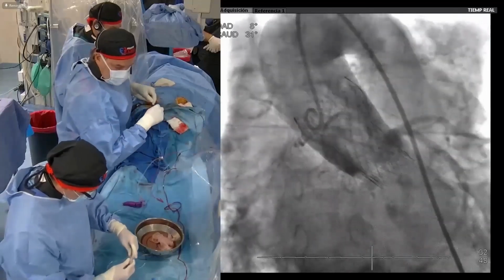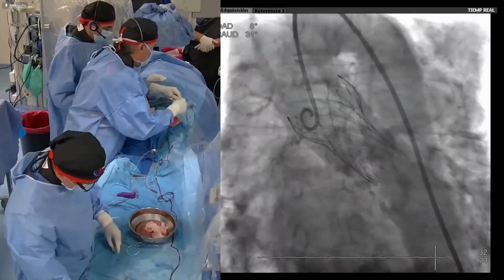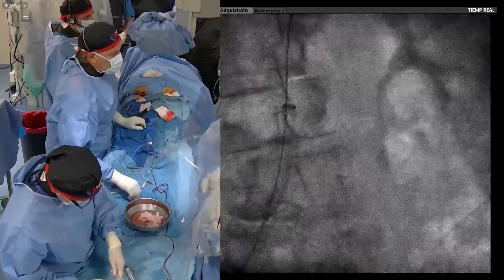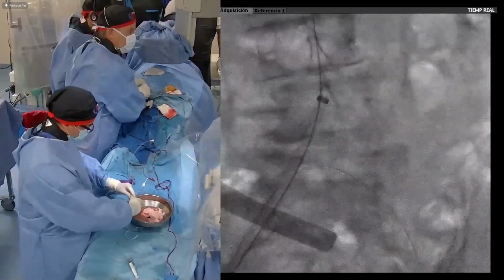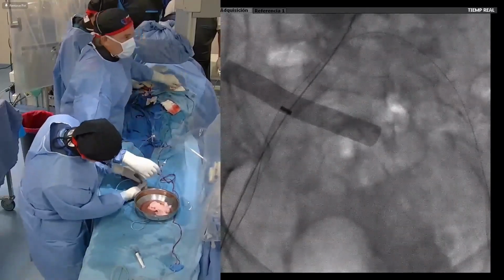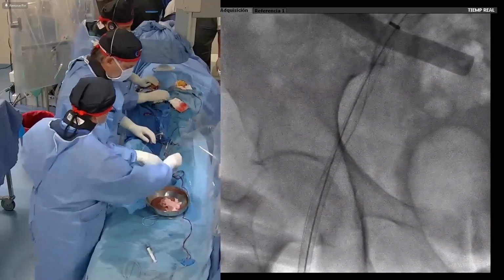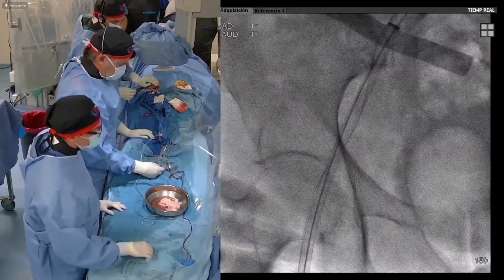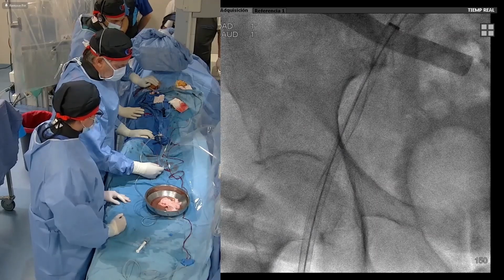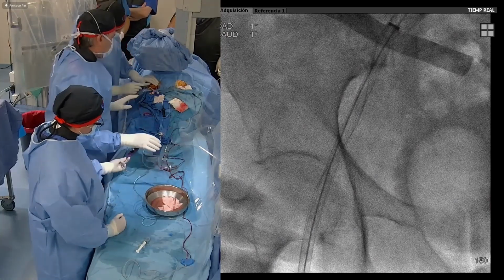Regarding pre and post dilatation, we belong to a team with Eberhard Grube that did the initial experience without predilatation because we thought at the time that without predilatation, probably we would decrease the stroke rate. But unfortunately, our theory was not that true. So now we are using predilatation according to each patient. I would say that probably 60–70% of the cases we predilate because we don't like to post-dilate, especially when we're using cusp overlap view and we implant the valves at a very high position to prevent conduction disturbances. So in this situation, sometimes post-dilatation is challenging, at least. Not risky, but challenging. No, move de vuelta.